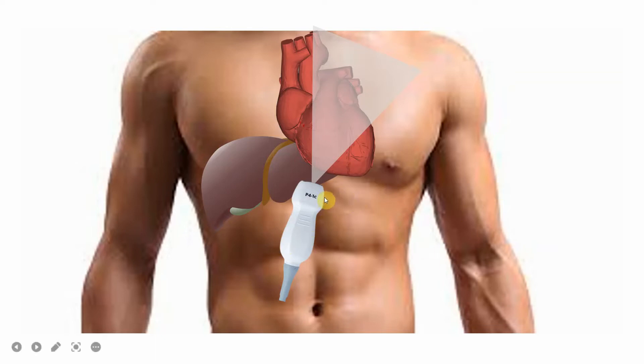There is some controversy about where the probe marker should be. Cardiologists perform this view with the probe marker on the left side, while ultrasonographers and radiologists put it on the right side. Because most teaching materials are produced by cardiologists, I personally prefer to put the probe marker on the left side so I can correlate with most journal articles. Keeping it simple, we will put the probe marker on the left side and get a good view from the undersurface of the heart.